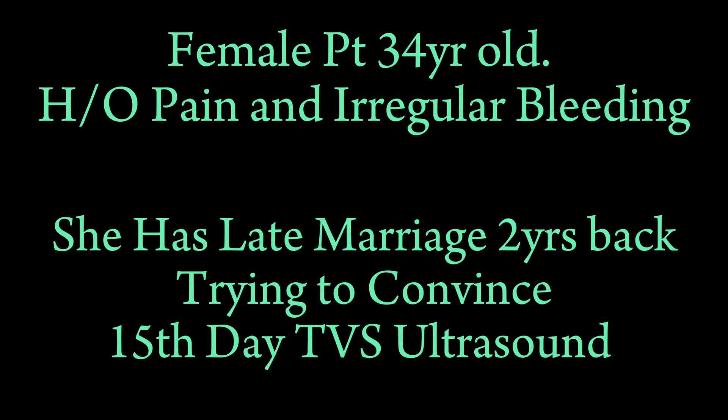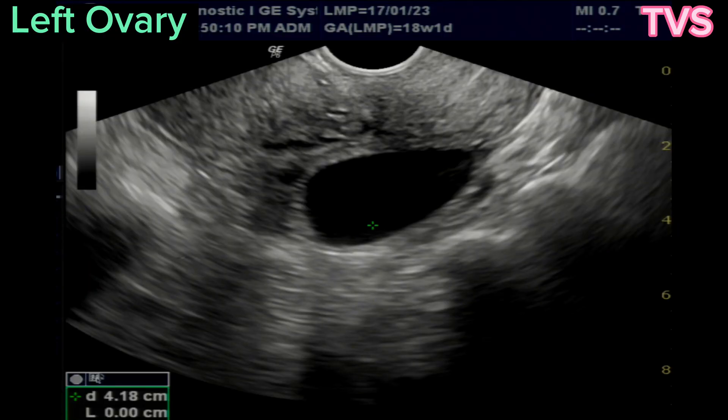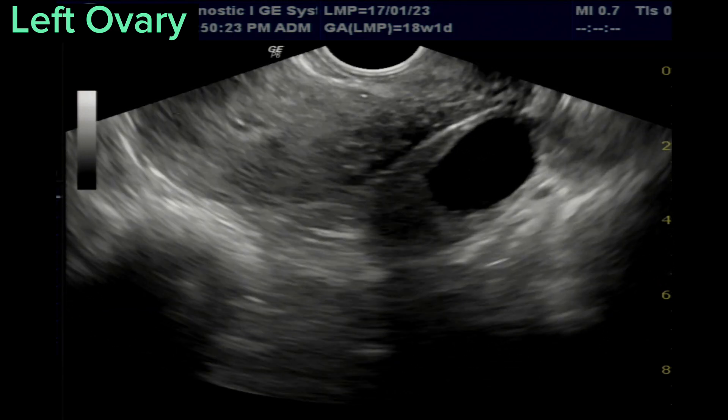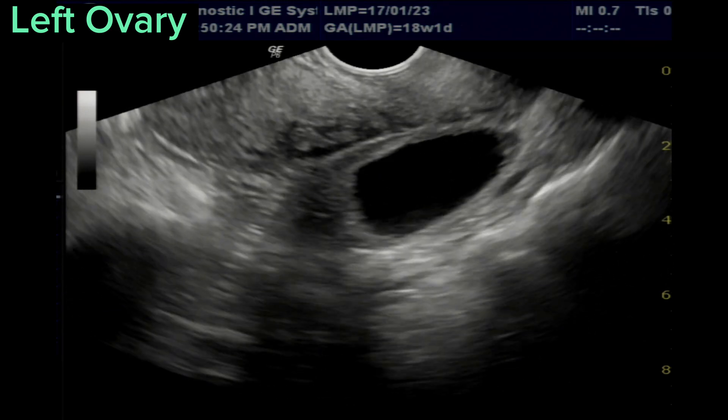This is a female patient, 34 years old. This is a late marriage case and she is now trying to conceive, taking medicines.